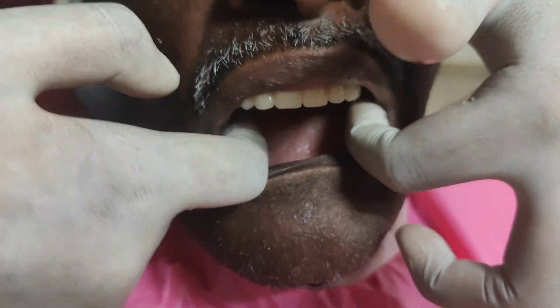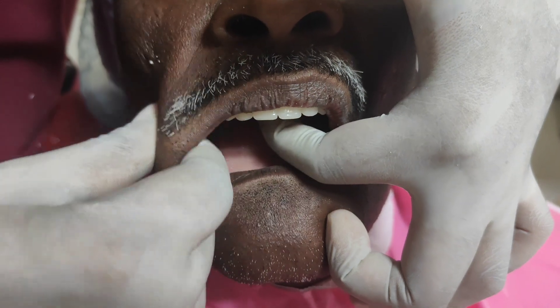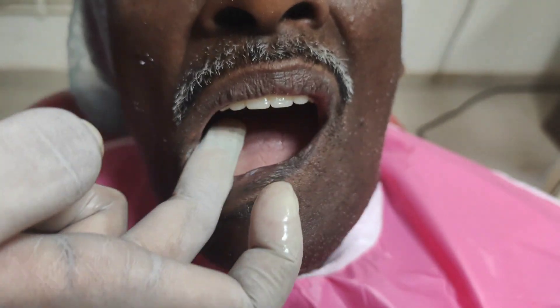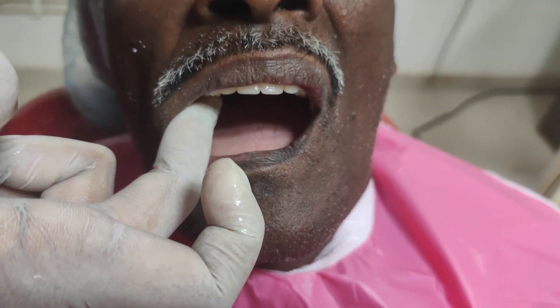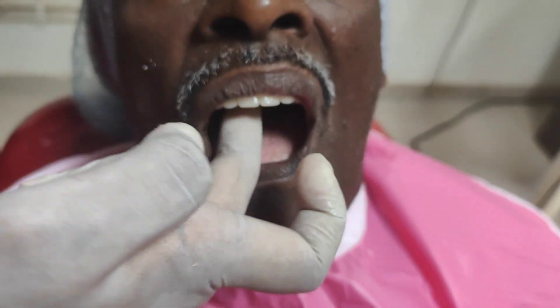After checking the anterior and posterior seal, the stability of the denture is checked by performing all border movements. The denture must also be pressed on one side so that it does not lift on the other side, which indicates that the denture has perfect stability.